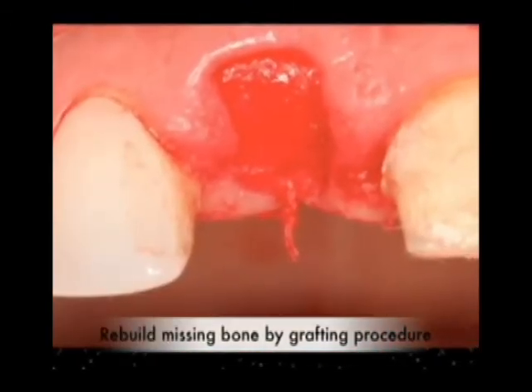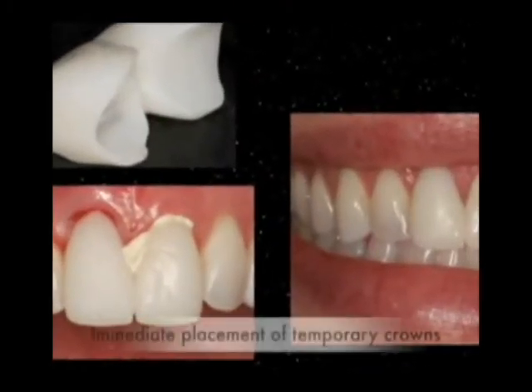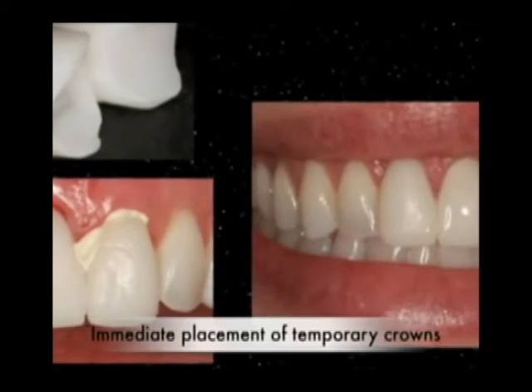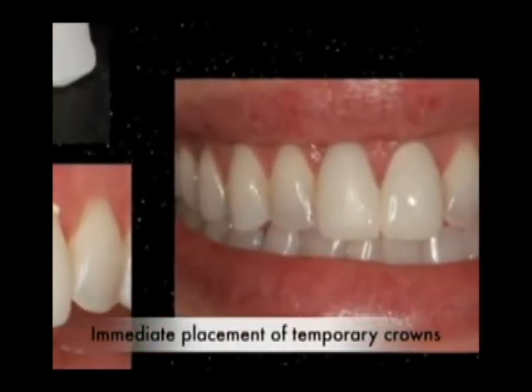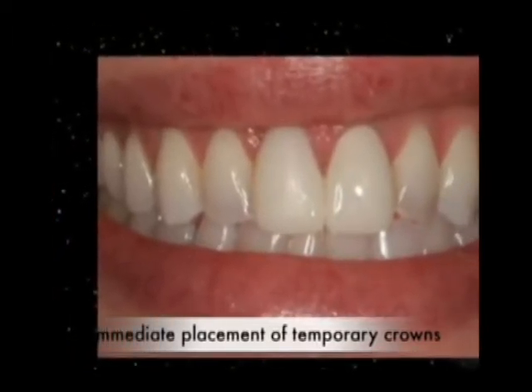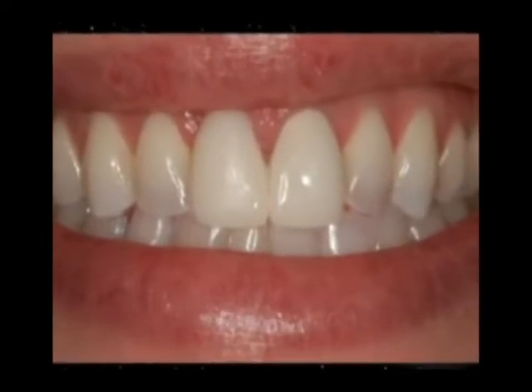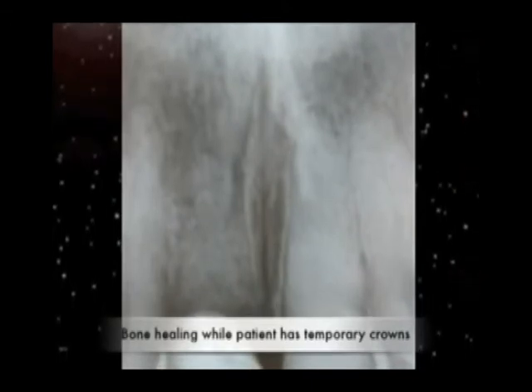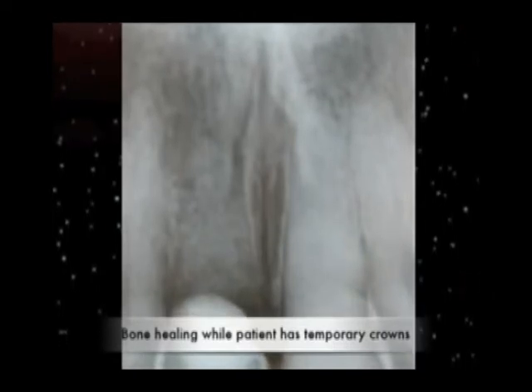And the reason why we had this provisional made or temporary made before the surgical site is so that we can immediately place the temporary into the surgical site and onto the adjacent tooth for support and have an immediate fixed restoration that's quite comfortable and natural looking for her while we allow the bone to graft and grow into the site and allow for eventual implant placement. So one miracle at a time, we put the bone in first and let it heal.